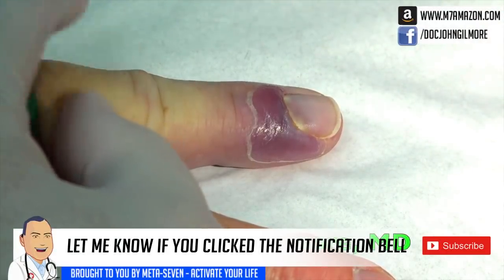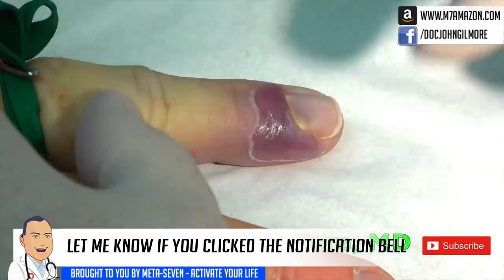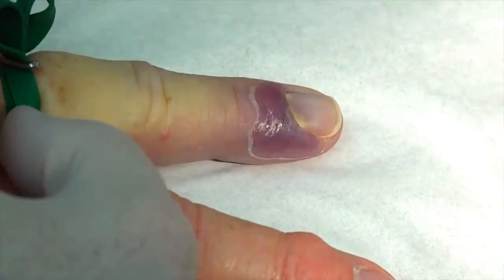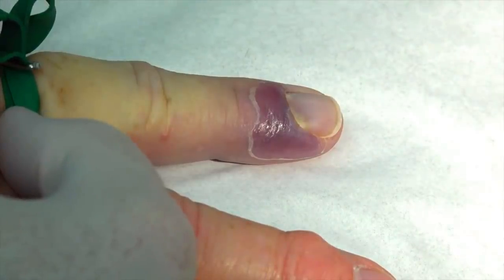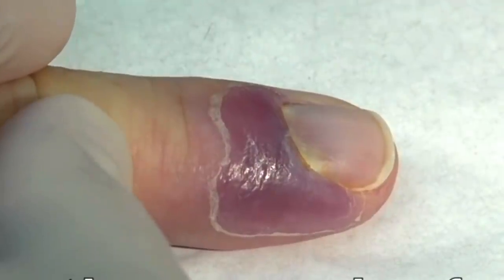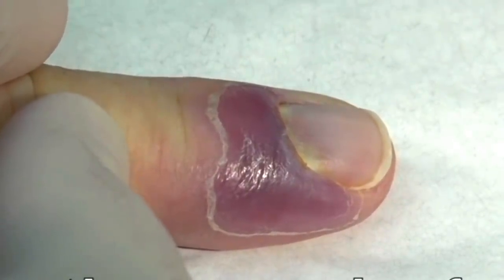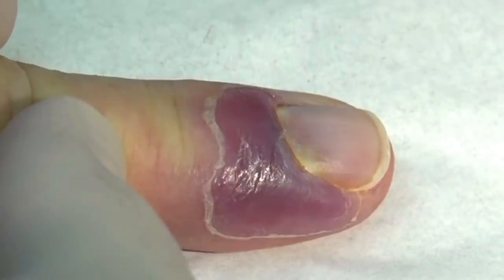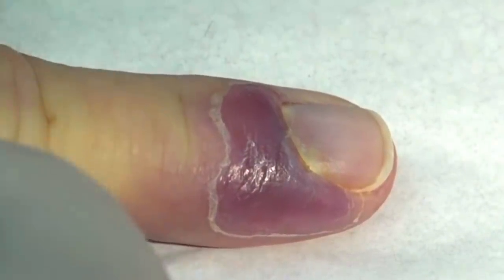What we did 10 minutes ago, we used this little tourniquet to provide some pressure on the nerves around the finger so we can give you a little anesthesia without injecting you. We're going to relieve the paronychia by using a scalpel to basically just make an incision into the cuticle. We're going to do it with a little cold spray and a little mechanical anesthesia with the tourniquet.